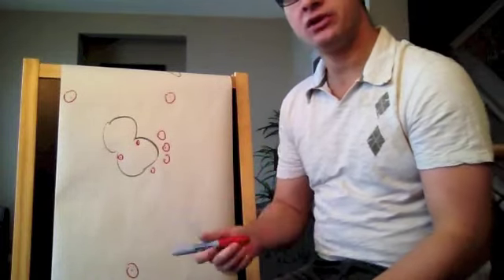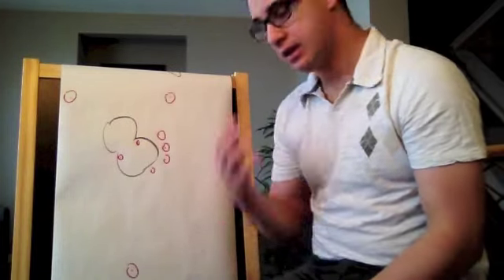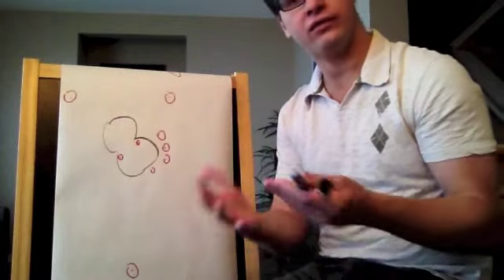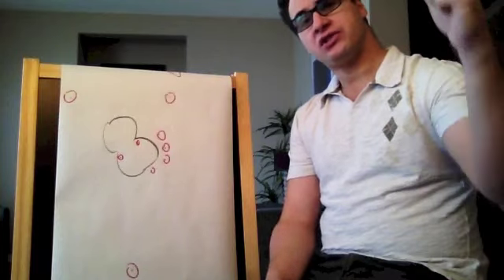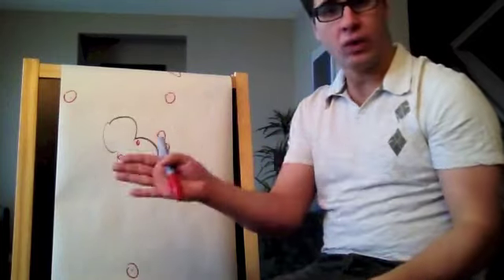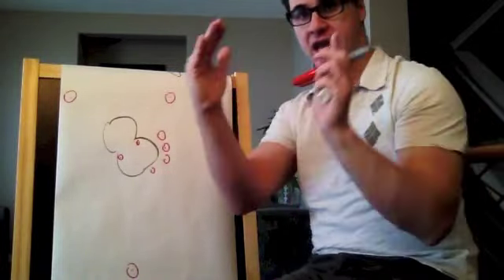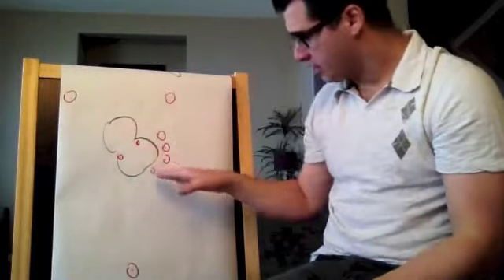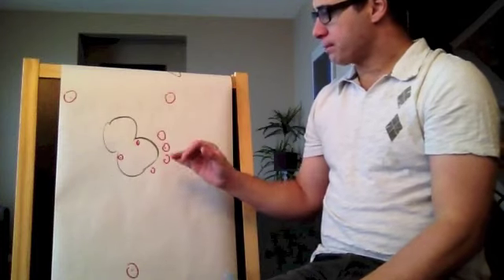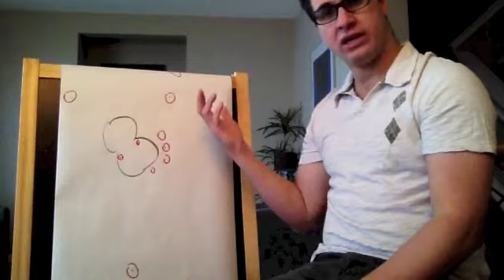When we do a 12 lead, we see electricity from 12 different ways. But it's the same electricity. This is what's important to understand. It's the same current that is going, so it's one beat. If we took that in our head, it's one beat that is going, and I'm seeing it 12 different ways. Then the other beat comes and I see it 12 different ways, and that's what shows me the electricity that is going. So to understand what we're seeing on the 12 lead, we need to understand what I'm reading.